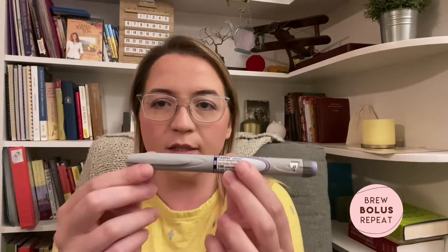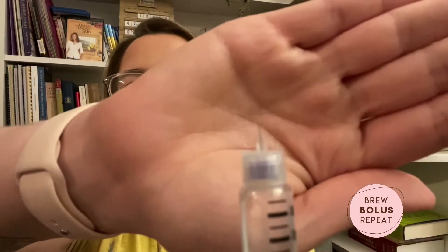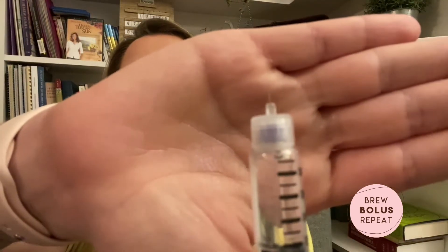I'll show you what I currently have. I've been using Lantus as my long-acting insulin and Humalog as my short-acting, and I use pens. So this is my Lantus pen. I've got a pen tip on there right now — one of the really tiny micro-fine ones.